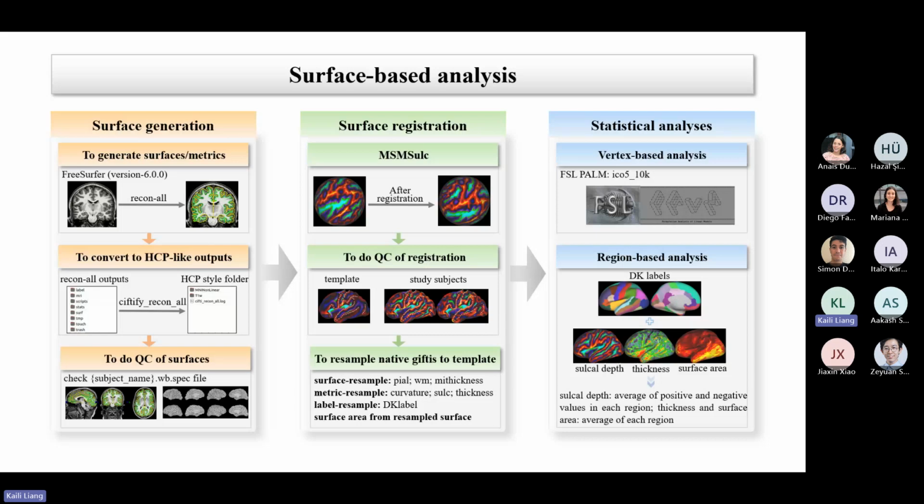So I was making the case that classical pipelines are dead and they should move to learning-based pipelines. There's this FastSurfer that we could try at some point. It's supposed to be better. FastSurfer is a learning-based implementation of parts of FreeSurfer, similar to what Chang was trying to do, but with FreeSurfer. I think they use a deep learning segmentation, and then everything else is a fast implementation of the classic pipeline or something.